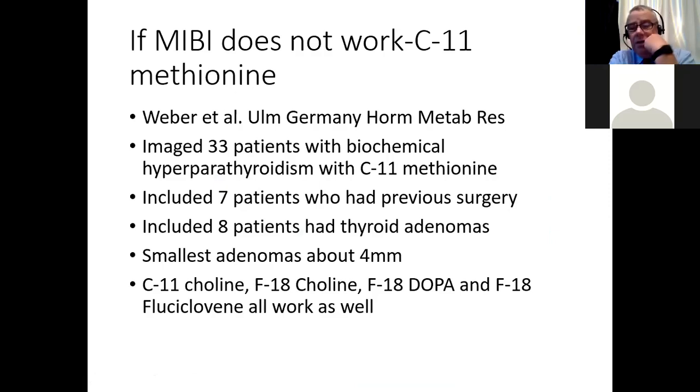Now, when we did lots of audits and publications, we found that ultrasound found about 90% of parathyroid adenomas, and MIBI found about 90%. Not always the same 90%, but there were about 7% of patients that were negative on both ultrasound and MIBI. So the question is, could we find a PET agent that worked with this?